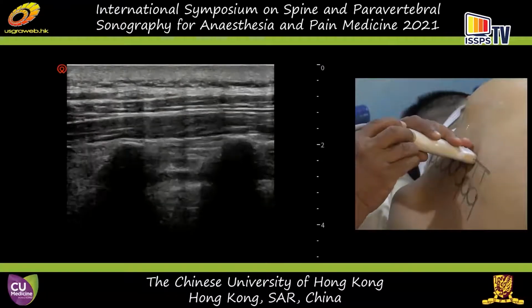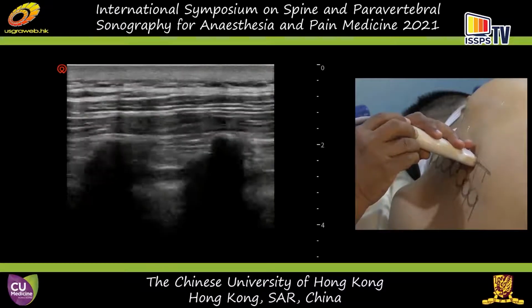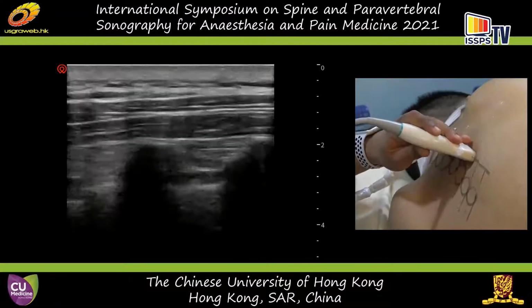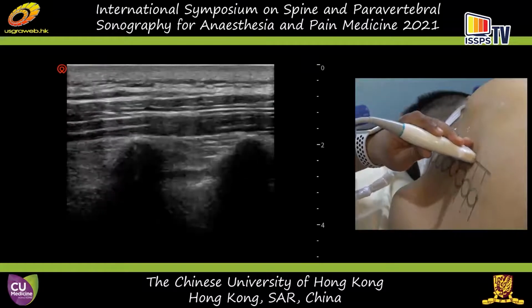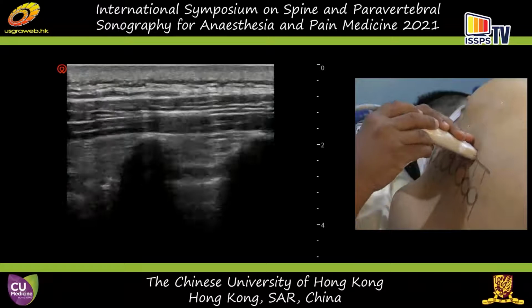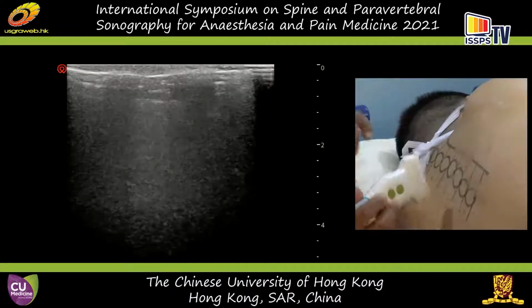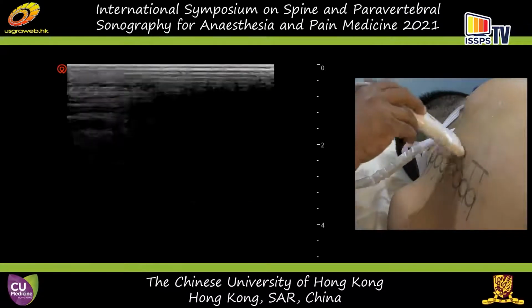And when the ribs become more anterior, as in some of the thoracic spaces, then this space can become very limited. In any case, it can be a useful site for performing paravertebral injections with low complications despite the limitations that I alluded to. Okay, now once you've identified the space, let's take a look at the anatomy for epidural injections.